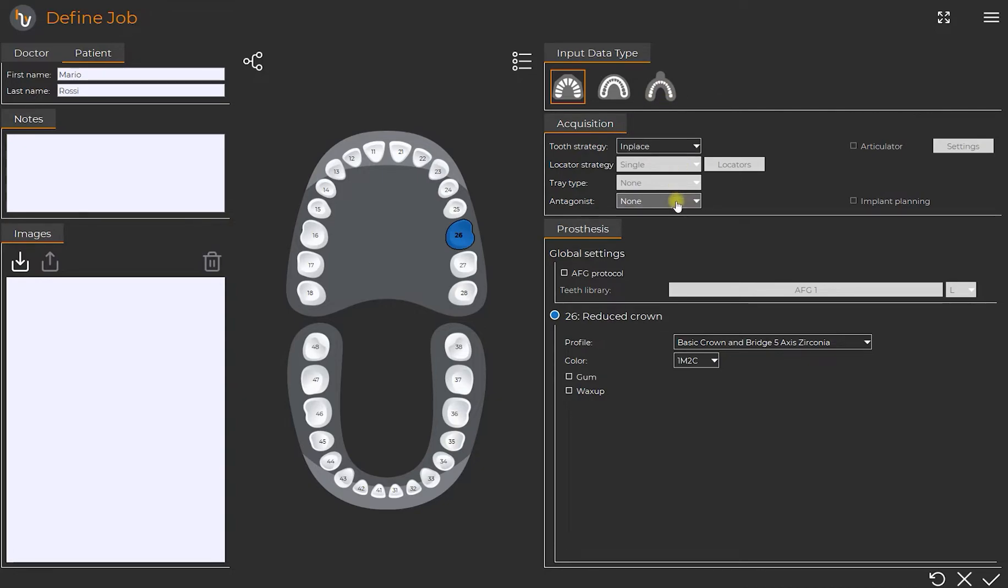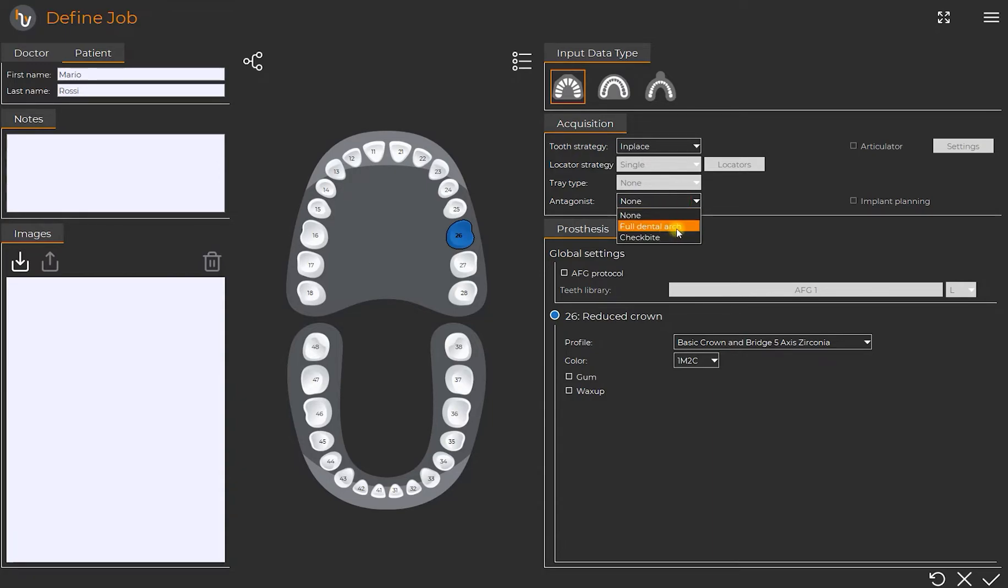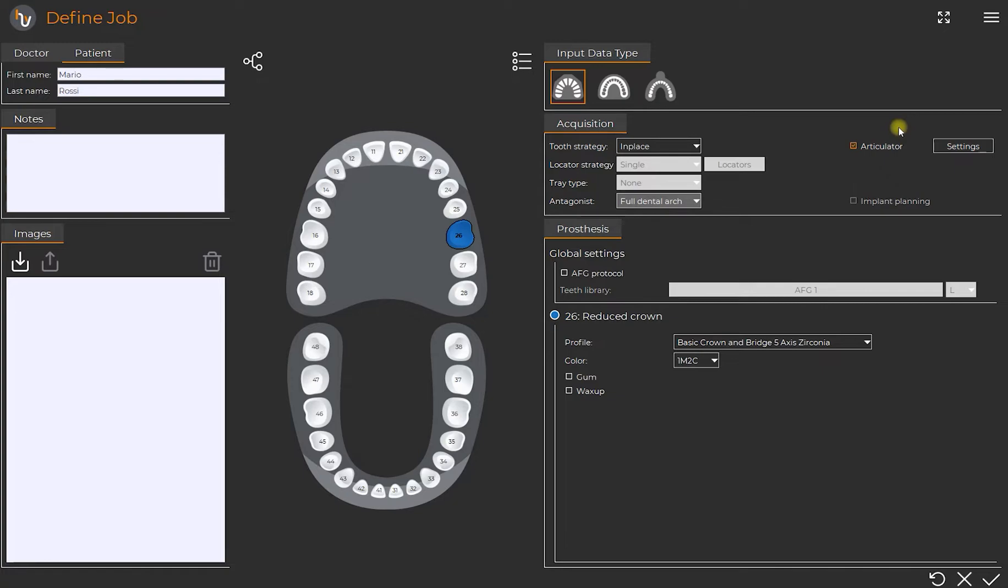Right below we will have the information regarding the scanning face and the antagonist if present. If selected, the articulator function will activate automatically.